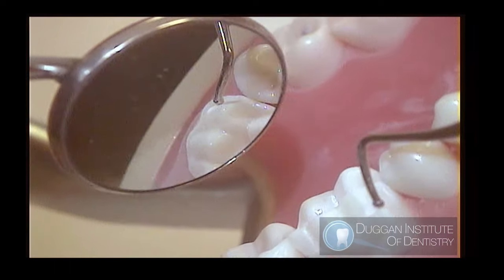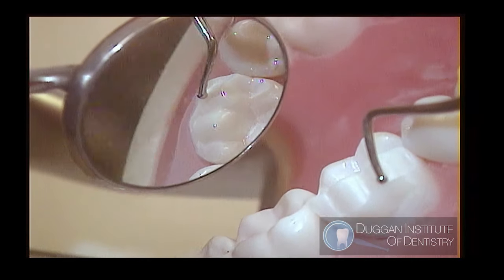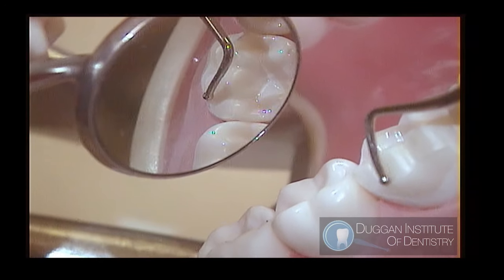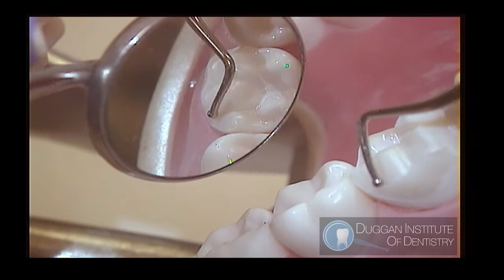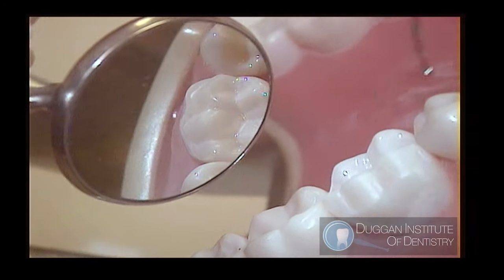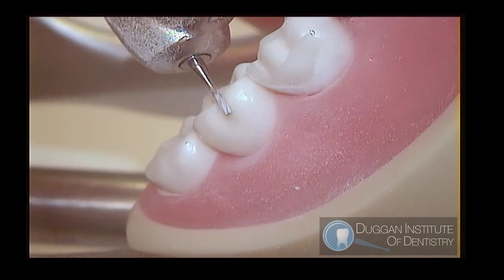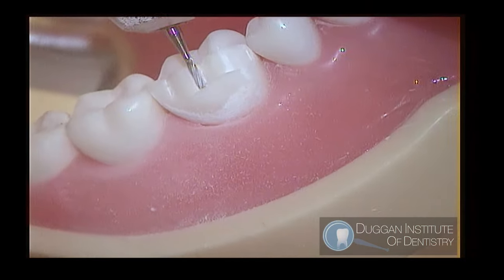We continue reducing until our ledge measures 1 millimeter to 1.2. Leave a little more room to reduce for when we finalize the occlusal reduction.